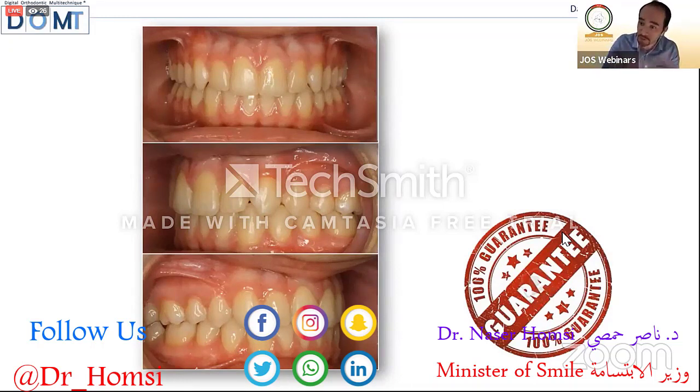rescans or new impressions? Well, the question is very simple. The question is, there are two possibilities. The first possibility is more sophisticated, and you can see here with the first question, the ideal is to use a CBCT. Okay, you take the shape of the teeth.